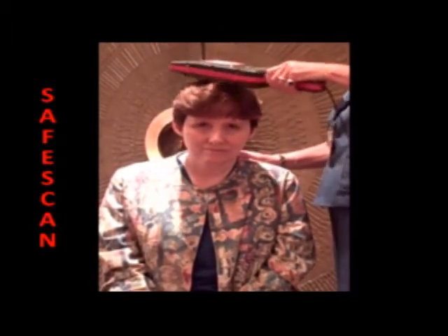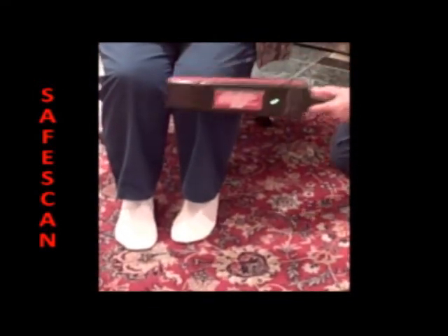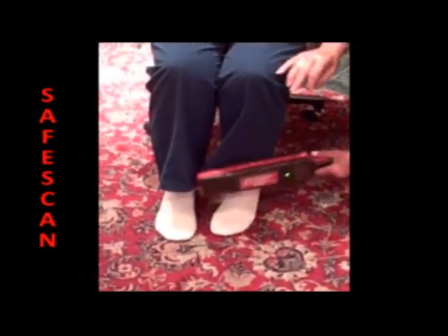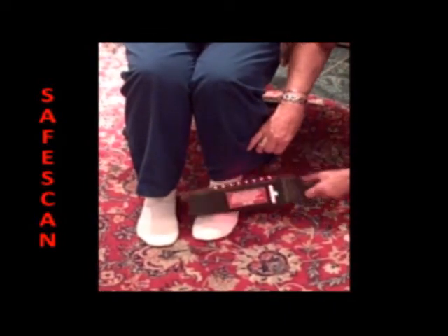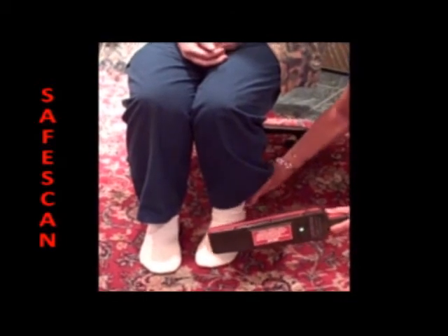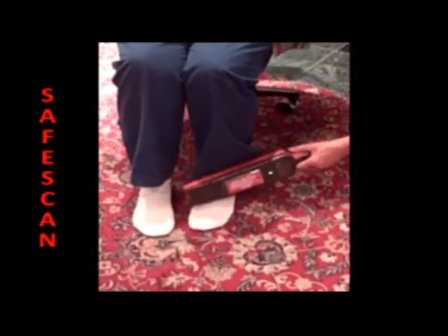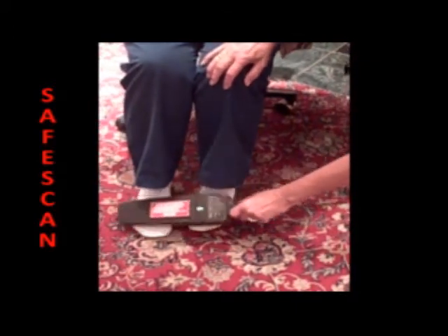Now, with the patient still seated, go directly to the feet area looking for ankle magnets or an ankle bracelet. Here a ferromagnetic threat has been identified and is removed. After removal, re-scan the foot area.